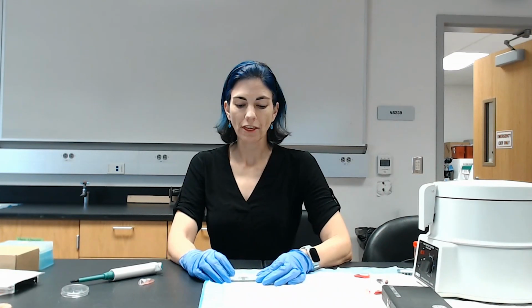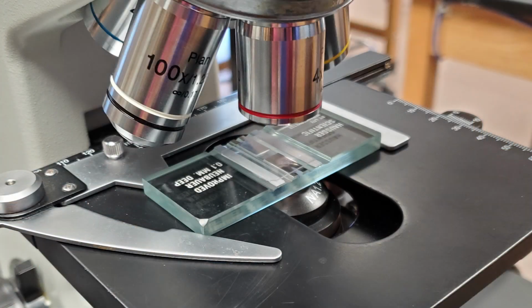Okay, so now that we've loaded up our hemocytometer with our diluted blood, now we're going to put it under a microscope, and I'm going to zoom in and show you where you need to be counting.